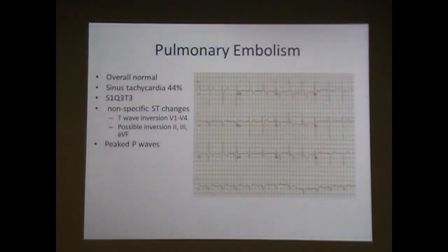How well can you guys see this actual EKG from back there? Do you guys want to scoot up? Because we're going to be looking at a lot of EKGs, and I try to make them as big as possible. Probably have to dim the lights. Yeah, can we dim the lights? Absolutely. There's a switch in the back.